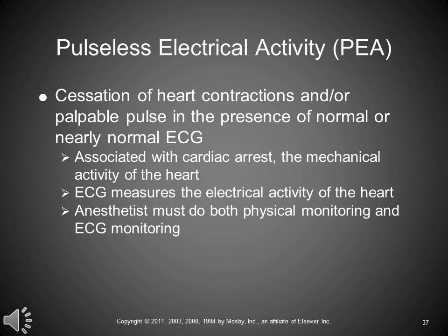ECG measures the electrical activity of the heart. Okay, the heart can be at a perfect standstill, and the ECG can still keep going. In fact, sometimes if you monitor patients you have euthanized, they're spread with cancer everywhere or something, and you give them something, they're dead, heart stops, you may still get a normal EKG, and that can really get to you.